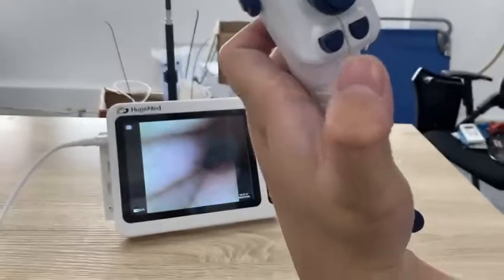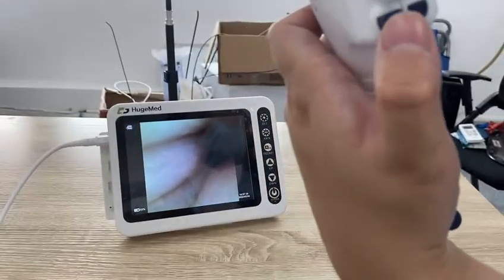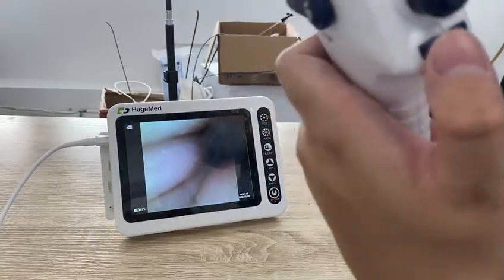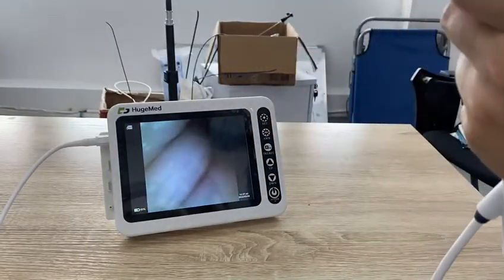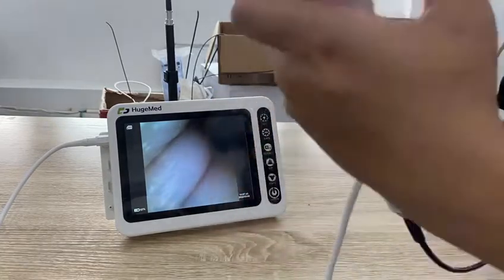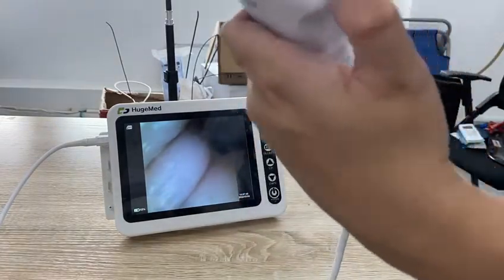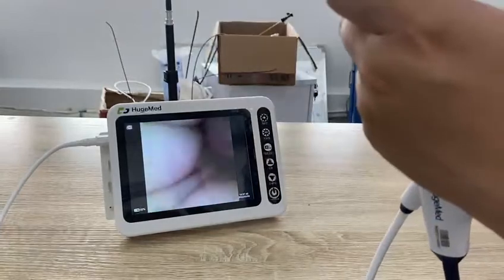There are two buttons on the handle. The left one is for freeze. I will show you — now, whatever you move, it's frozen. Press it again and it's moving again.